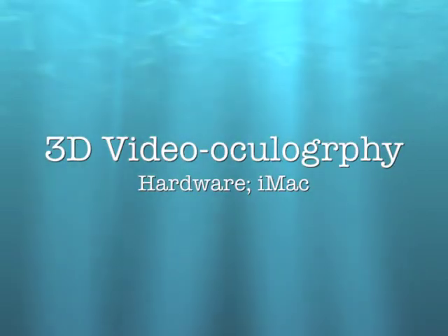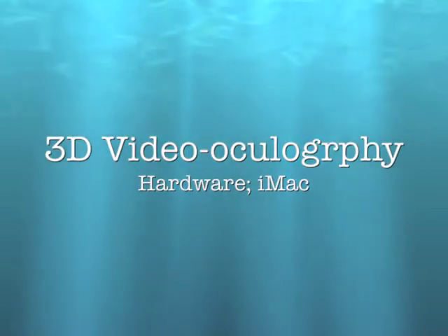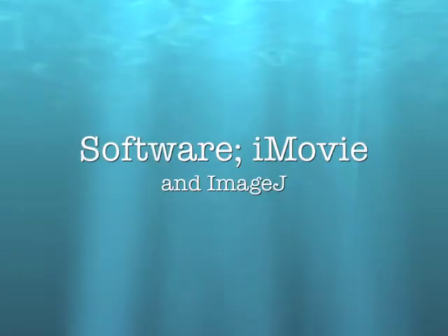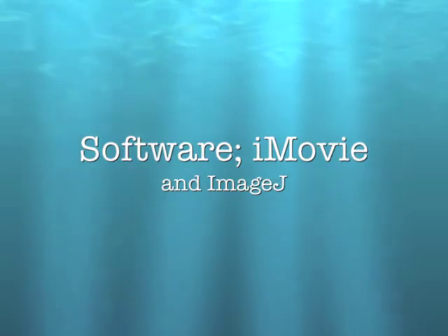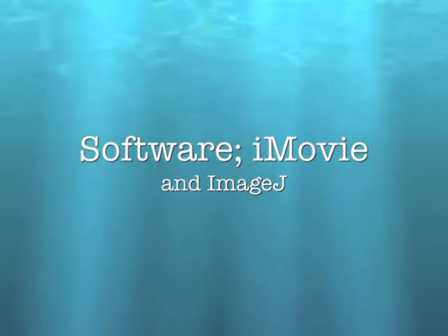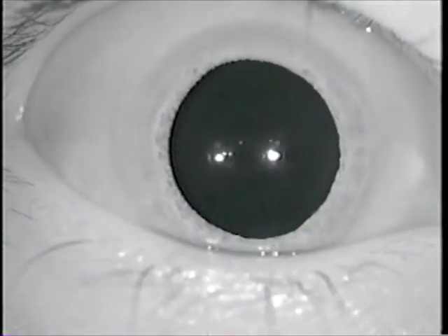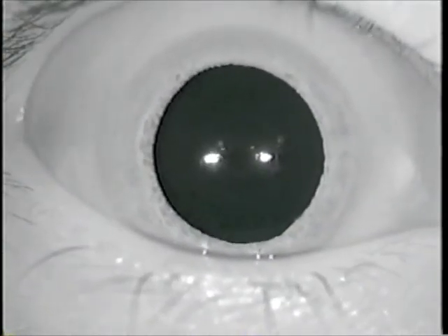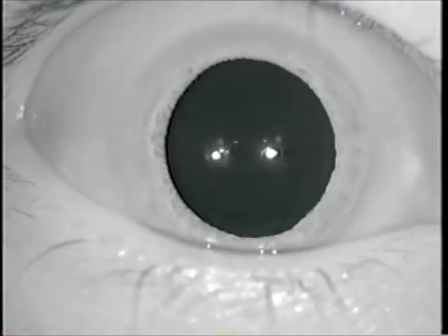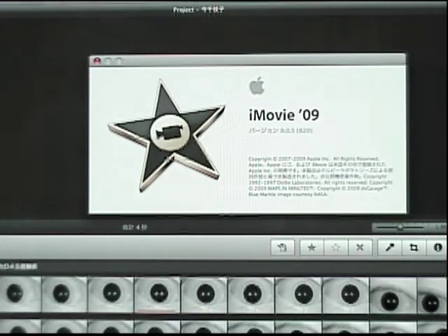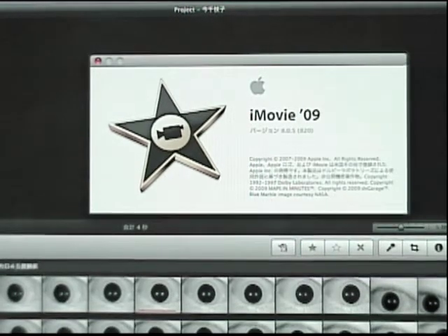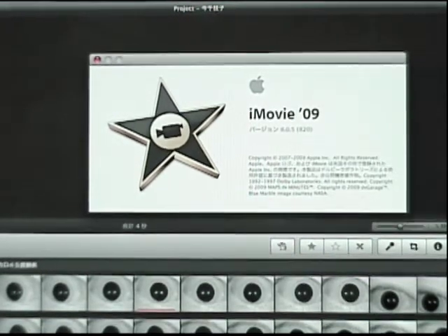I'd like to explain how to perform 3D video oculography. First, we have to import this time's video to iMovie.